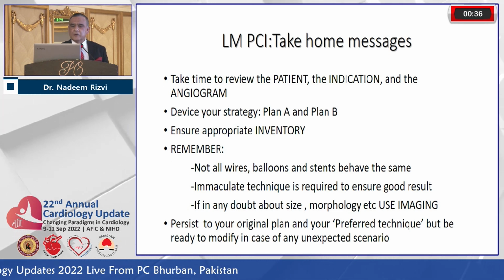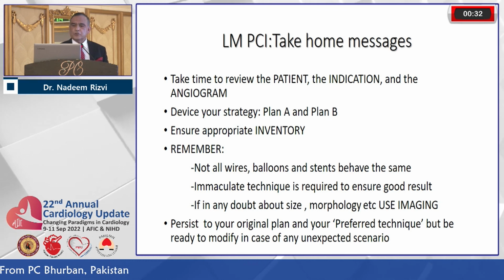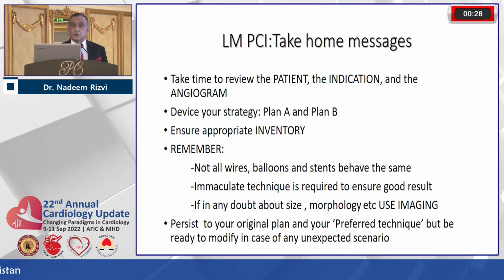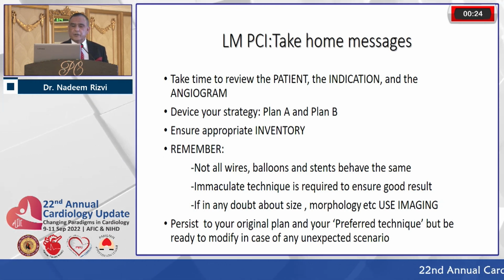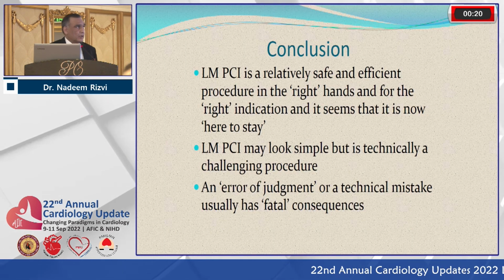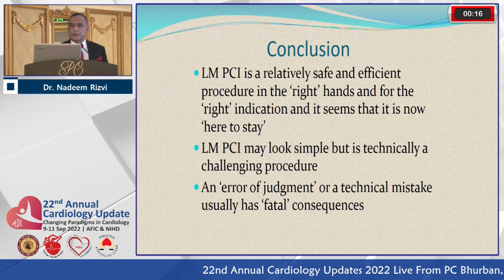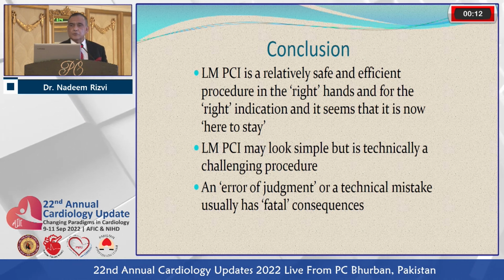Remember, not all wires, balloons and stents behave the same. Immaculate technique is required to ensure a good result. If in any doubt about size, morphology, etc., use imaging. Persist with your original plan and your preferred technique, but be ready to modify in case of any unexpected scenario. Left main PCI is a relatively safe and efficient procedure in the right hands for the right indication, and it seems that it is now here to stay.